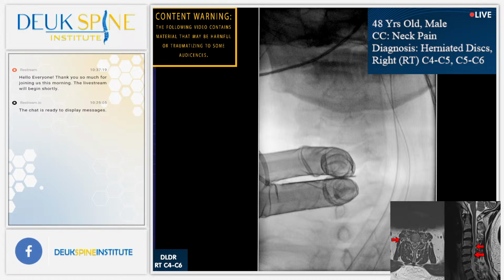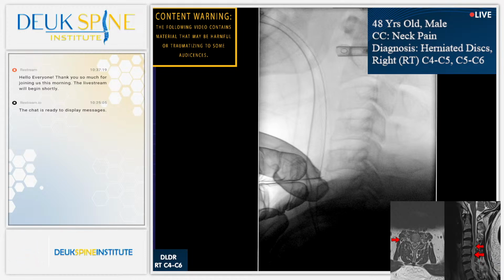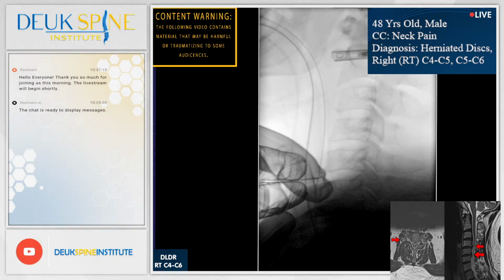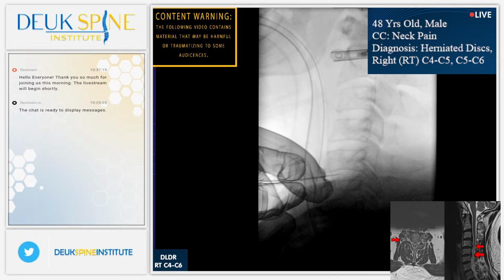Shot. Good. AP. I can feel the front of the disc now. Quick AP. Very good. That's really nice there, actually. Shot. So to do the surgery, I have to displace the trachea and esophagus.